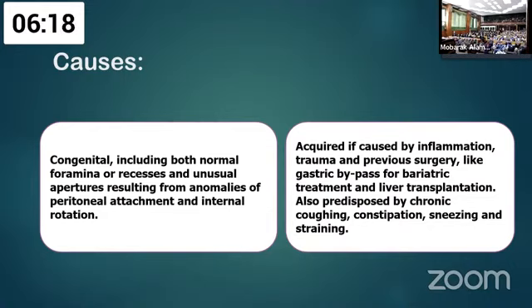This is the classification of internal abdominal hernia. I already described left and right paraduodenal and pericecal. The other type is transmesenteric hernia, which occurs along the small bowel mesentery, from the ligament of Treitz to the ileocecal junction. This type of hernia is now increasing in incidence due to gastric bypass surgery, especially Roux-en-Y anastomosis. Another type is foramen of Winslow hernia, which is located between the stomach, liver, and pancreatic tissue, and can cause gastric outlet obstruction and obstructive jaundice.